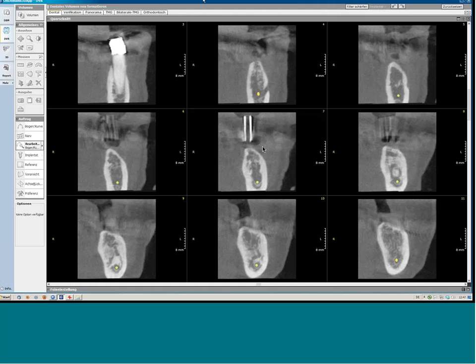Okay, so you see a very easy difference between spheres or metal balls and these kind of titanium cylinders, or whatever you want to use for these kind of acquisitions.